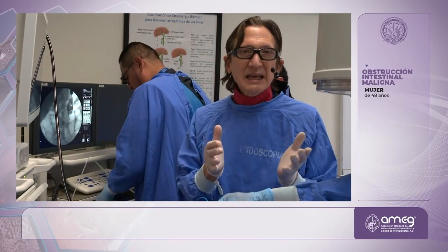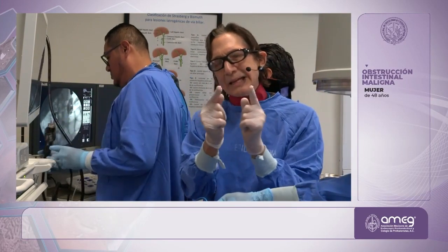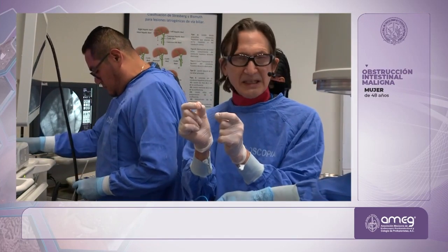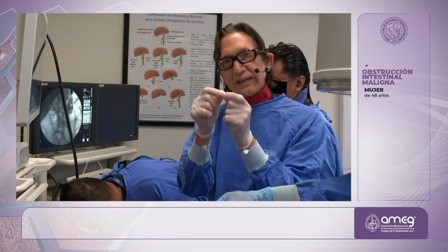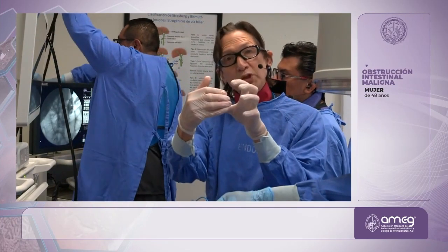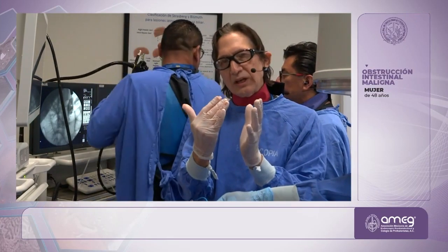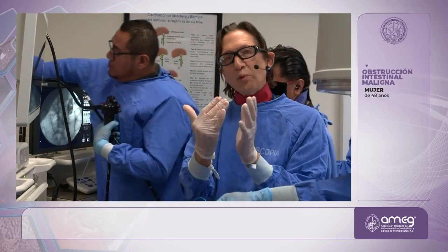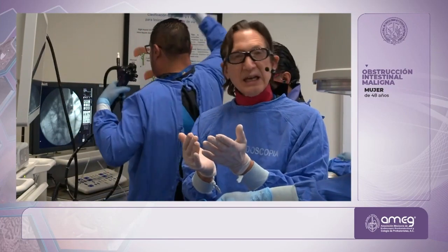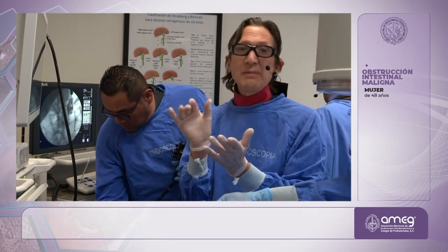That's basically, the ligament of Treitz always comes, there's actually a suspensory ligament that is between the stomach and the ligament of Treitz. So there's an actual suspensory ligament there that holds the two together. So it's a natural area of approximation of the small intestine with the gastric wall. So we want to take advantage of that. So we're going to be creating our gastroenterostomy at the ligament of Treitz.